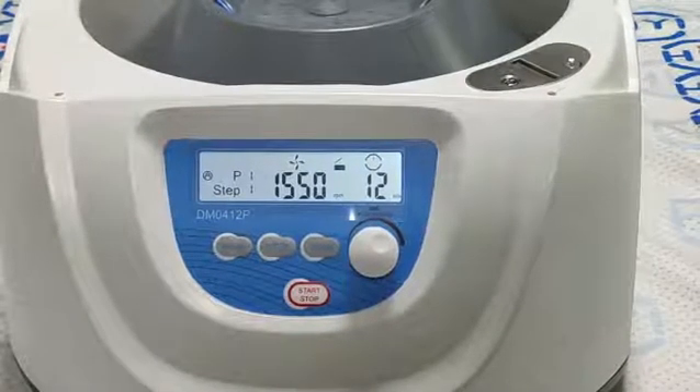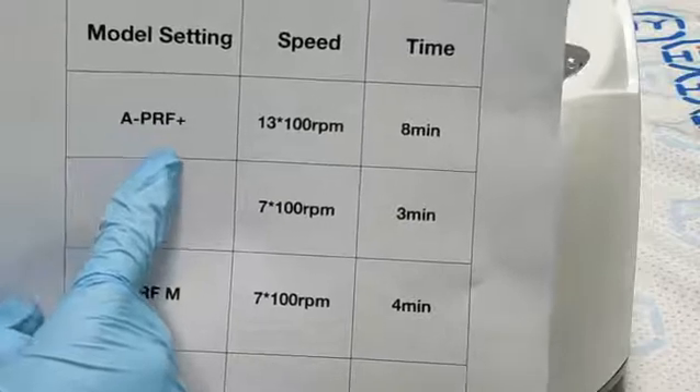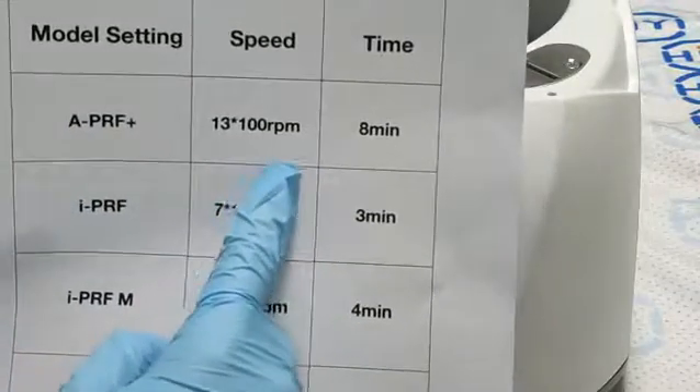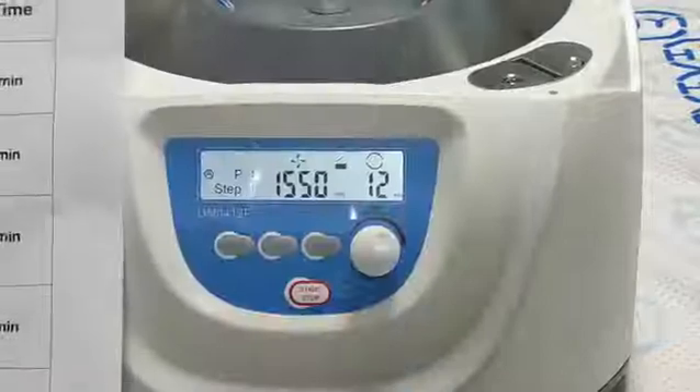We are setting program 1. We can see the speed. Program 1 is APRF+. The speed is 1300 rpm. The time we are setting is 8 minutes.